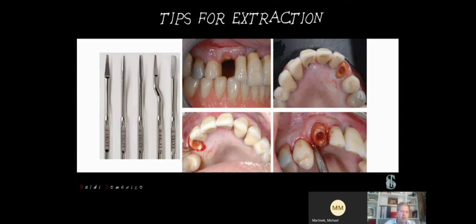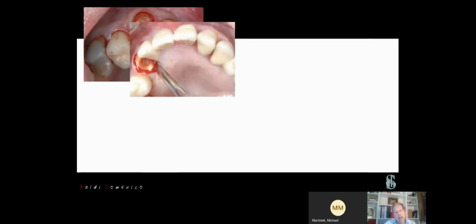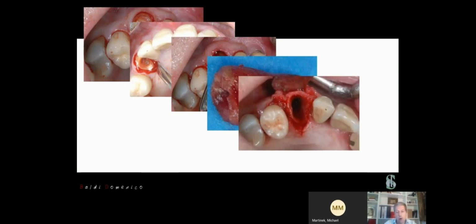We have different kinds of tips. So we can have tips to use like a periotome, and then we can use also some other instrument like a lever. And you can see how it's possible, starting from this situation, to manage our extraction in order to be less invasive, in order to maintain all the bone around our socket. In this way, we really get a perfect socket preservation.